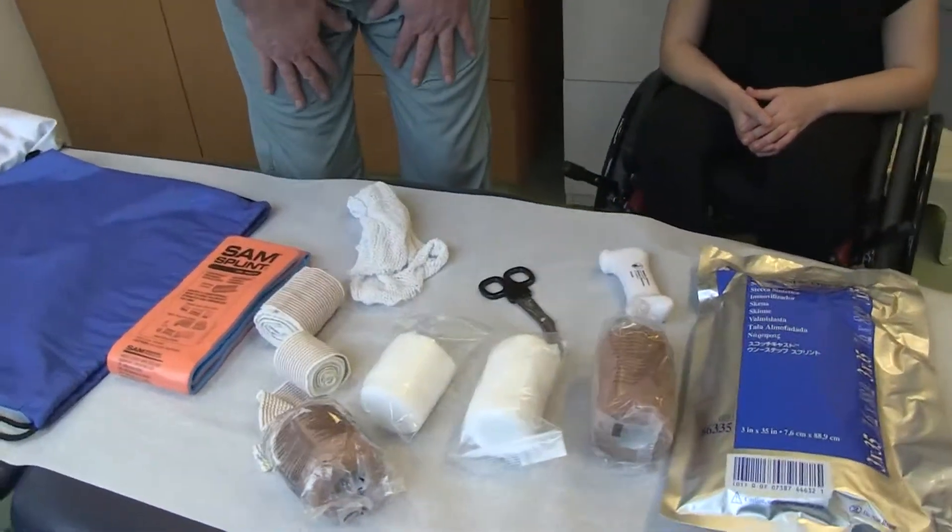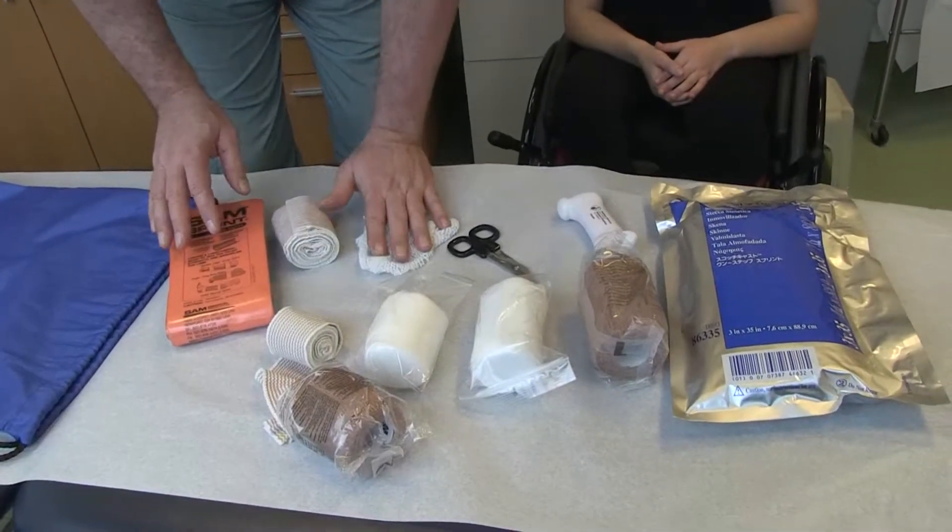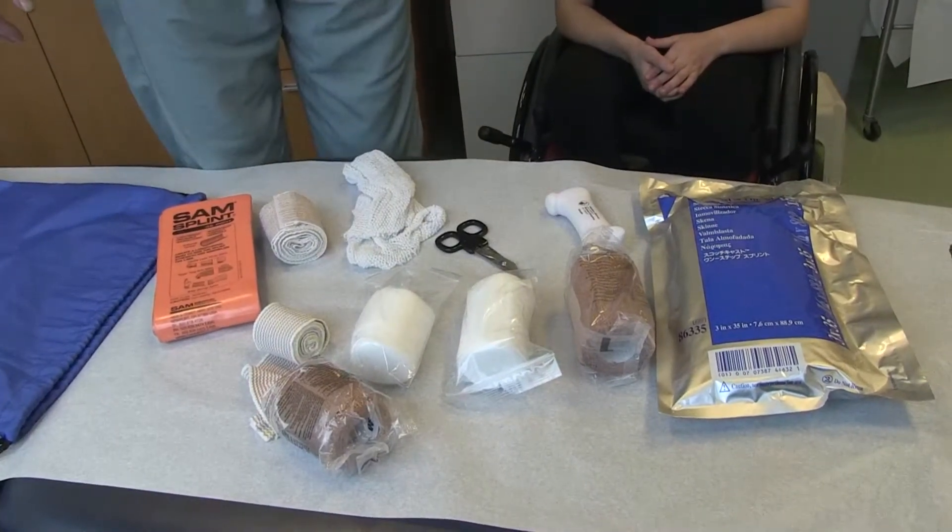What we will need from our tool kit today is the SAM splint, the three inches wide elastic bandage, and the immobilization mesh.